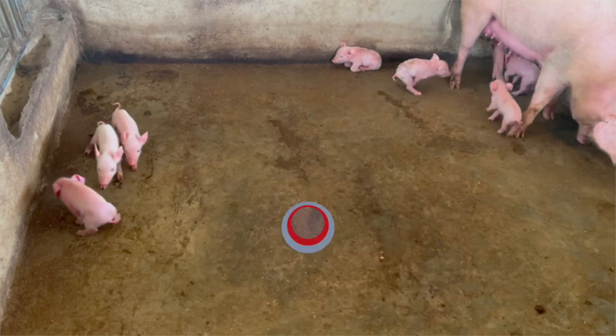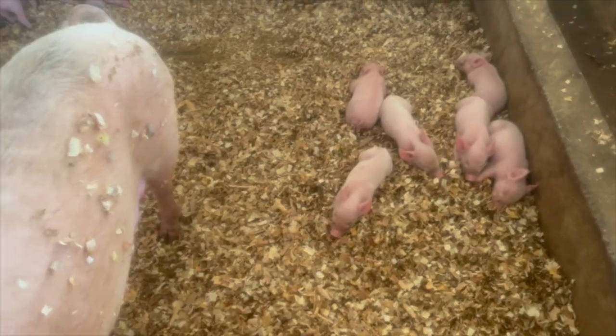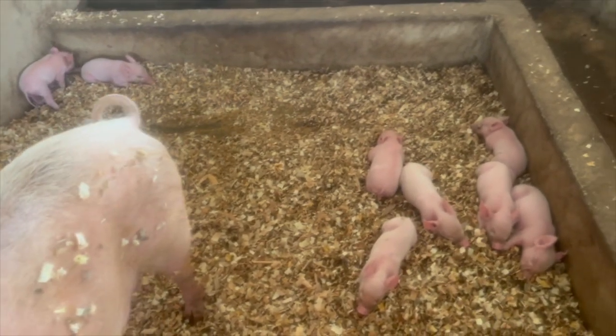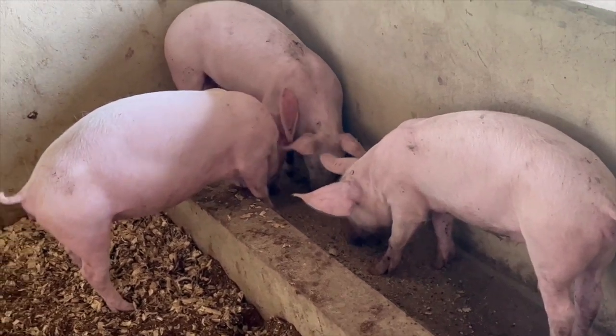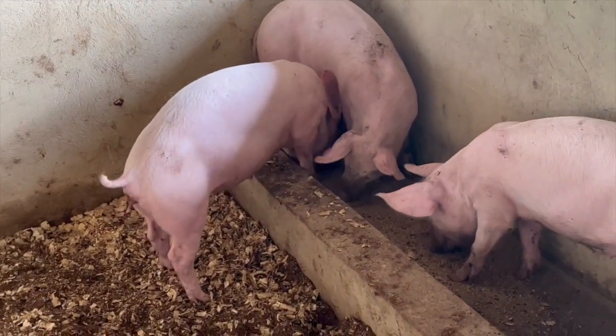The reason we got this device is simple. According to our data, we are supposed to have had more piglets than we have right now. We have about two or three pigs that are always playing hide and seek with their pregnancy — you cross them, they give early signs of successful crossing, they show signs of pregnancy, sometimes their bellies even look bigger, but then a few months down the line you realize they were not actually pregnant.